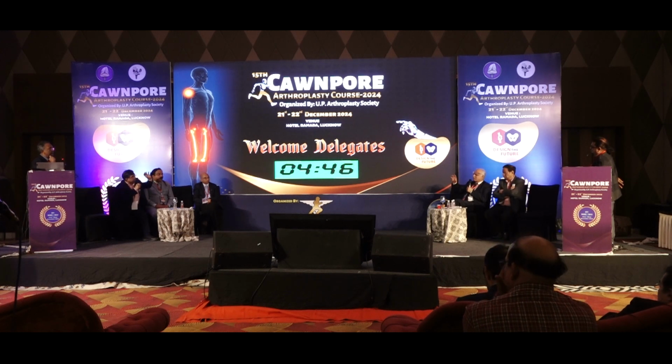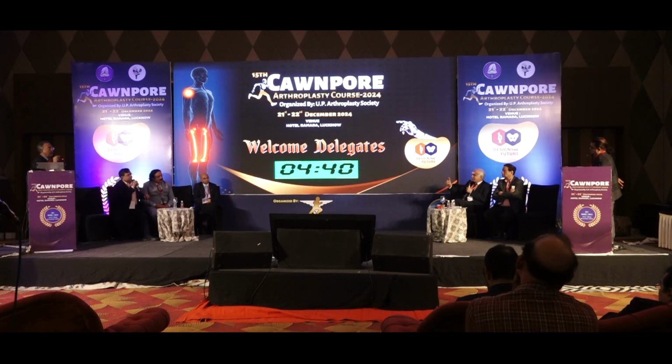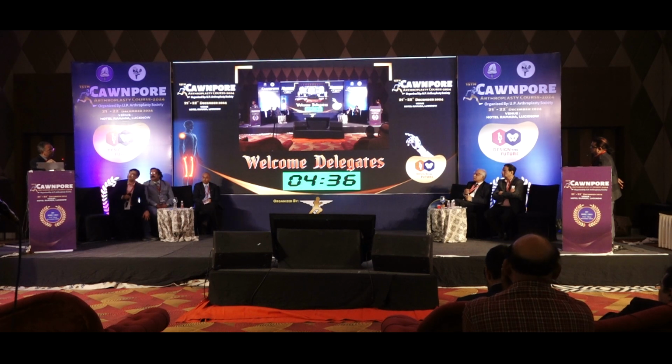Once you put the femur, my issue is adequate height to make it a good construct. I'm talking about height, not mediolateral. Height means we use a trial, and the different thickness spacers are there. So the same thickness tibial spacer is made, and then at the end you are cementing it.